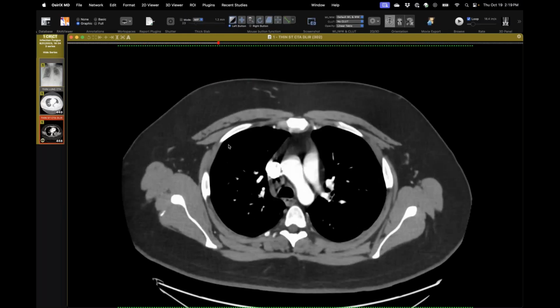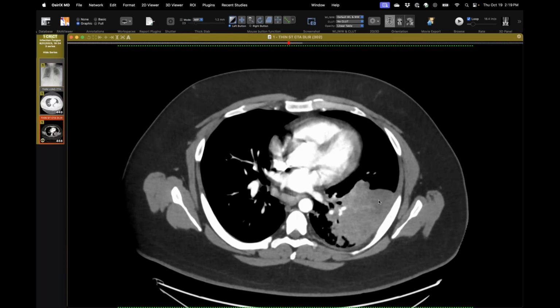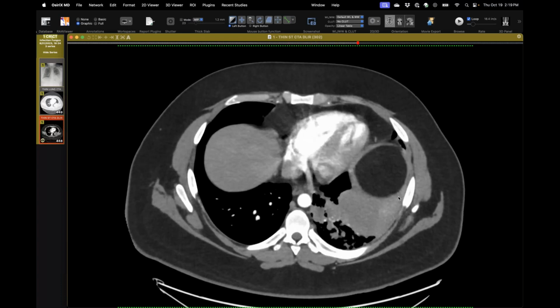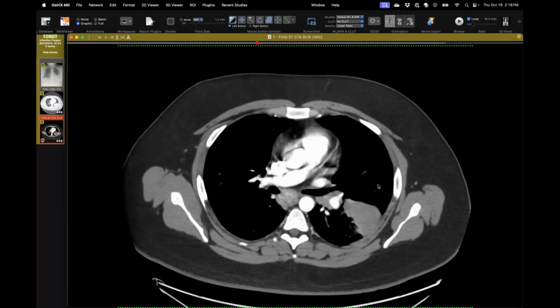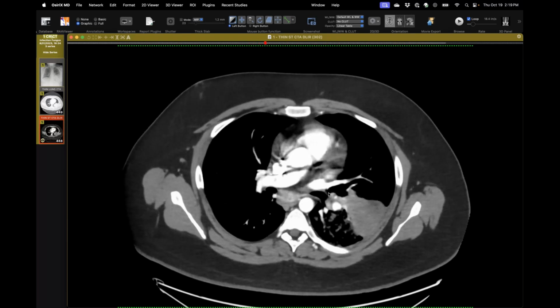And you can see this area is quite heterogeneous. There's some low attenuation in it. The vessels pass through it. The airways kind of drop out. It's very lobulated. Some, again, areas of low attenuation. And you'll see there's no pleural effusion. And there is some lymphadenopathy, but it's modest. You got some lower lobe nodes, some hilar nodes, this one chunky subcarinal node.